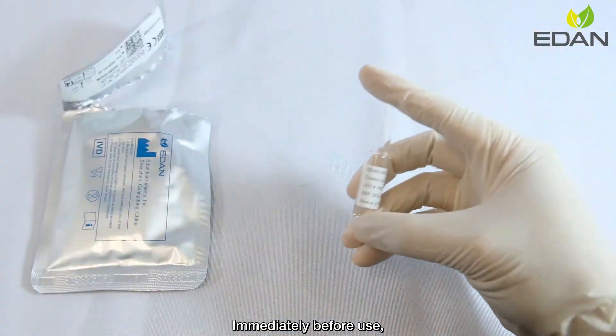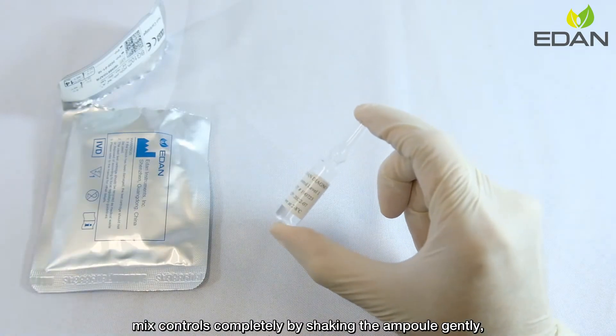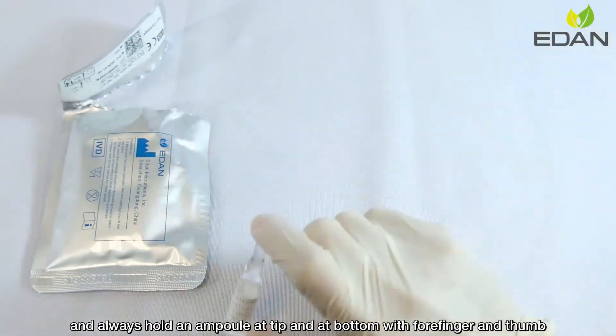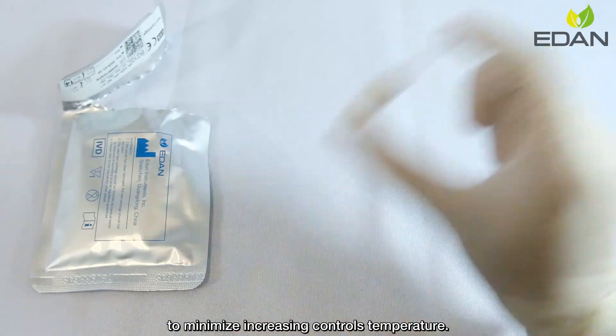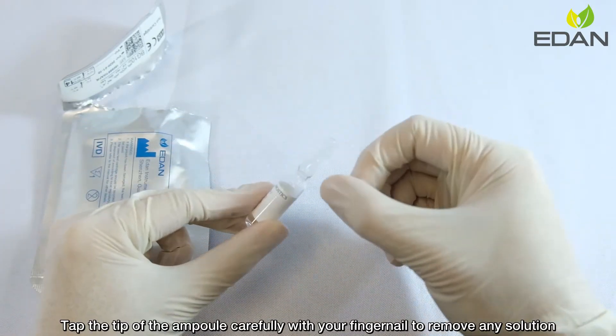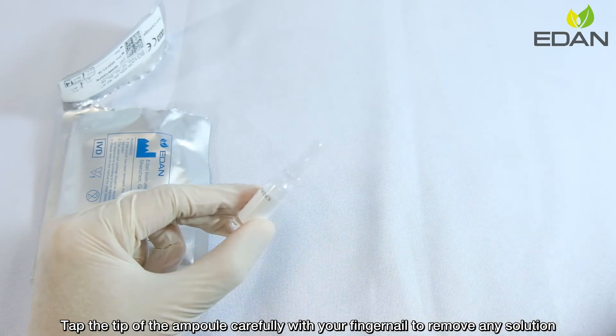Immediately before use, mix controls completely by shaking the ampoule gently. Always hold the ampoule at the tip and at the bottom with forefinger and thumb to minimize increasing the control's temperature. Tap the tip of the ampoule carefully with your fingernail to remove any solution.